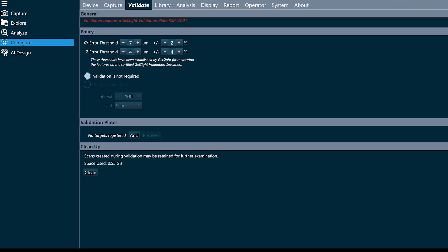In this video we're going to walk through the validation process. Validation is an optional add-on procedure that can be used to determine if your gel and gel site system are reporting within X, Y, and Z tolerances.